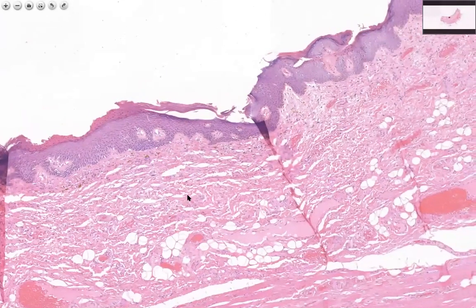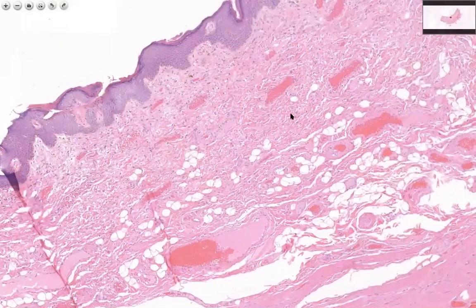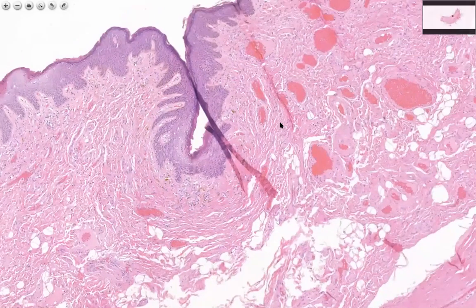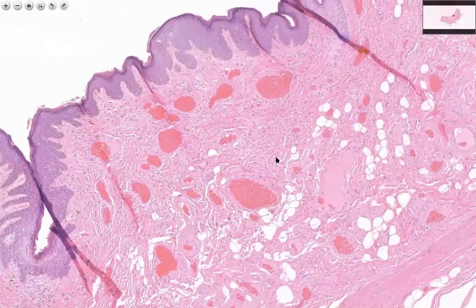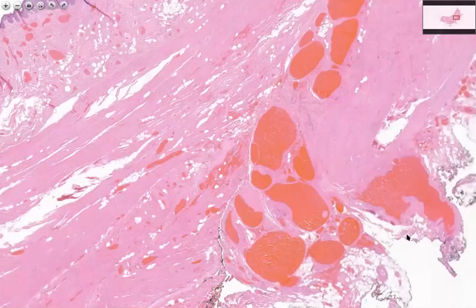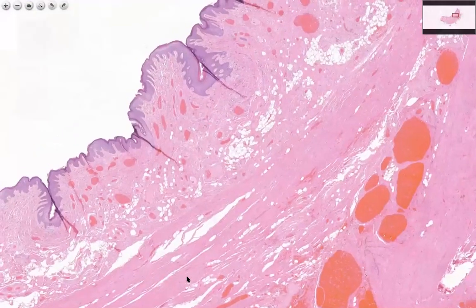In the anus here, the most common pathology we're trying to evaluate that is of clinical concern is the presence of squamous dysplasia. And so this parallels what we see in the cervix and the vagina. Other pathologies that can be seen here are cutaneous diseases of the skin, and also this is an area where patients can get hemorrhoids. And so when we have very large aggregates of dilated vessels, for example, such as down here, and the patient has the corresponding clinical symptoms, then we can make a diagnosis of hemorrhoids as well.